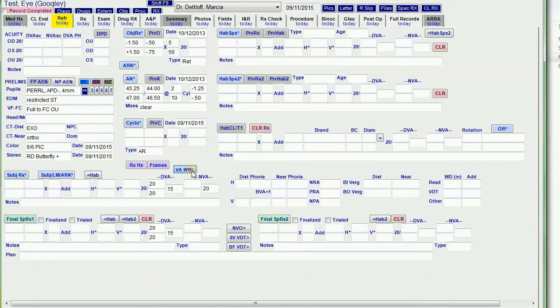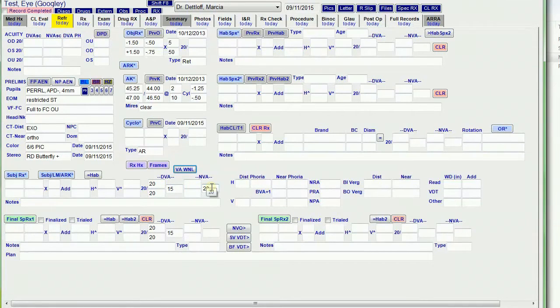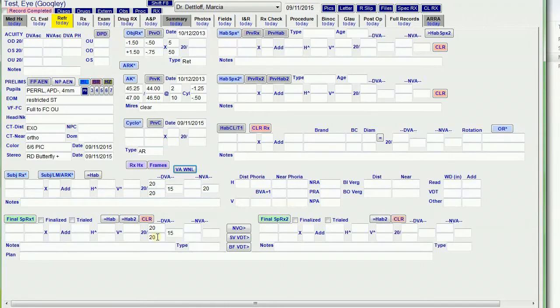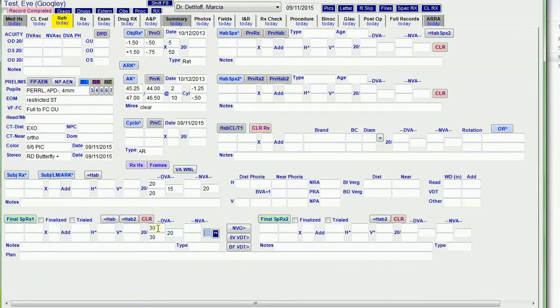VA within normal limits fills in the distance VA, 20/20, NHI, and 20/15 binocular, and 20/20 near VA. And these fields copy down to the final RX, but I can always overwrite them for some reason I want to.